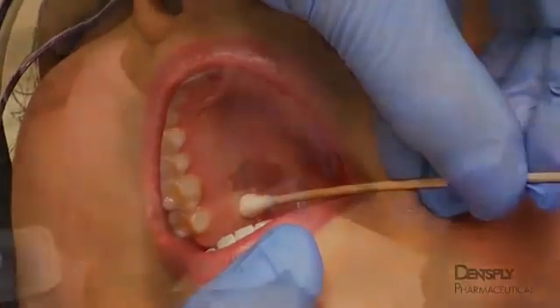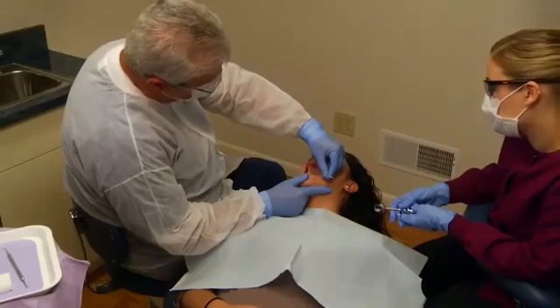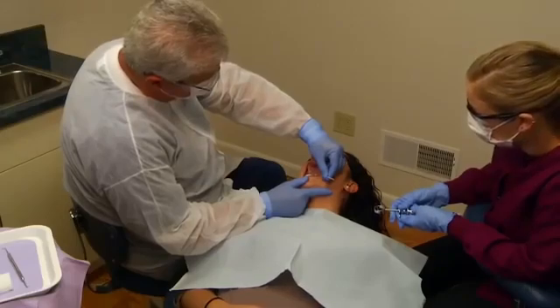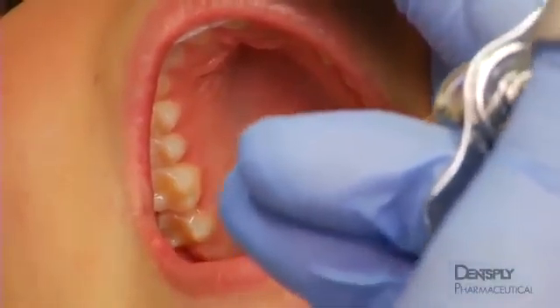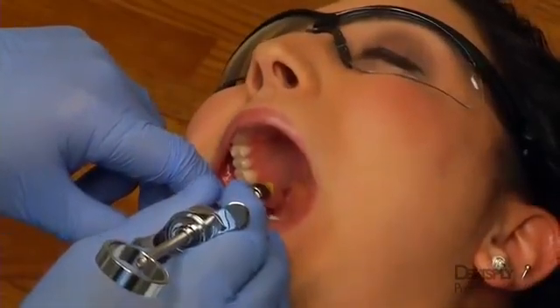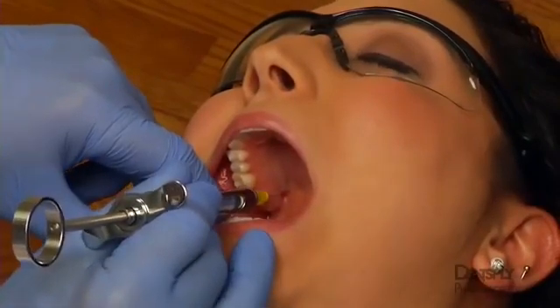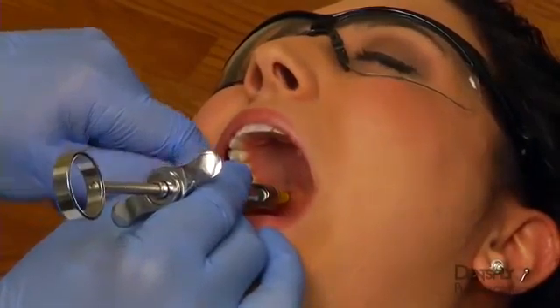created by the foramen. Topical anesthesia of the hard palate is not easily achieved with conventional preparations. Additional anesthesia may be obtained by applying pressure to the injection site with a cotton-tipped applicator. After about 20 seconds, the needle is inserted into the foramen as pressure is maintained and 0.1 to 0.2 milliliters of anesthetic solution is slowly deposited. After waiting 2 or 3 minutes, the needle is advanced slowly through the greater palatine foramen and up the pterygopalatine canal. A pen grasp of the syringe facilitates the gentle probing that may be necessary to navigate the canal.